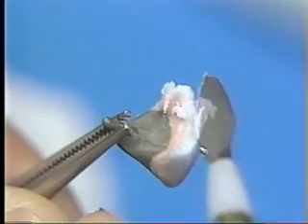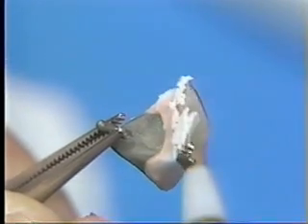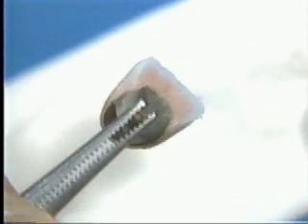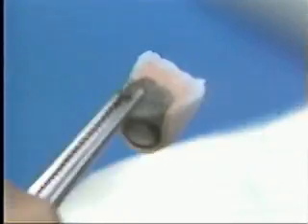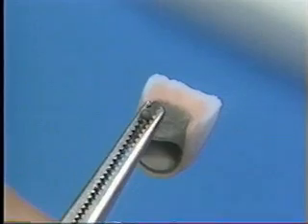Cut off the porcelain cleanly from the incisal edge on the lingual surface. Slightly smooth the surface of porcelain with a brush, and here is the finish of body and enamel porcelain buildup.